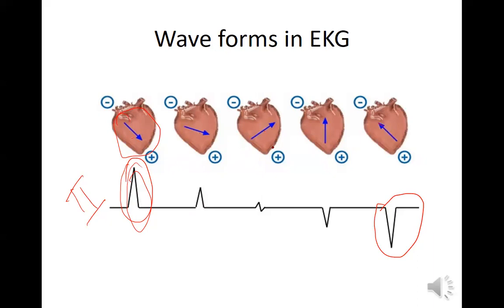That's where the machine is picking up that depolarization. Okay. Thanks to Einthoven. And so the vector is also the direction. Like the mean QRS vector is the biggest vector. It's a mean of all the other vectors. So the vector has the direction. Really, it's about direction mostly.